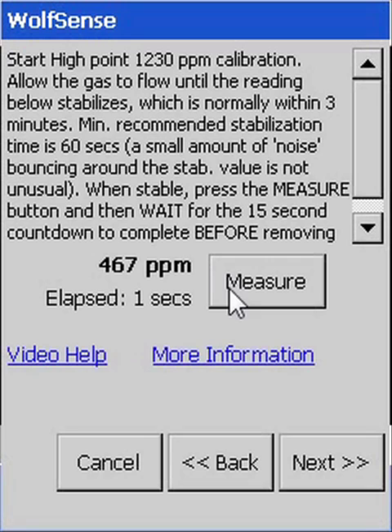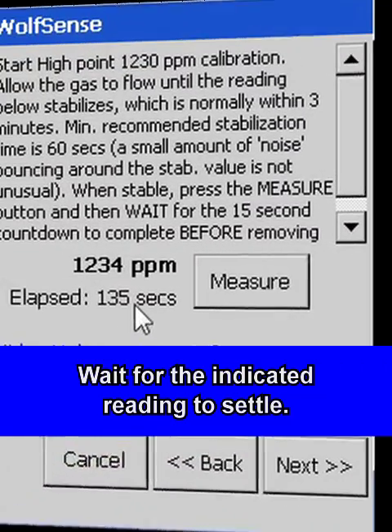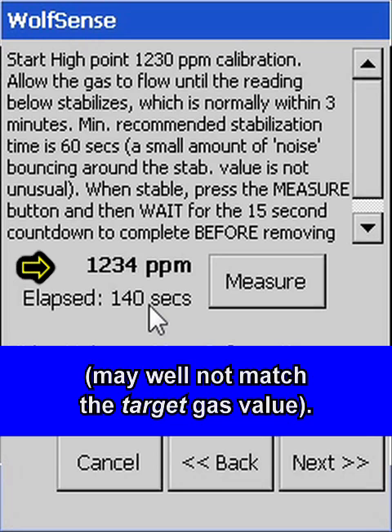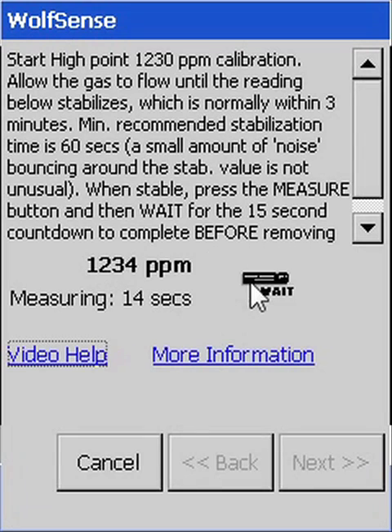Repeat the procedure for the high or gain reference gas. Two-point calibrations — first low, then high — are always recommended. However, near the beginning of the calibration procedure, you could have selected a single point, either high or low, if you are only concerned about one end of the sensor range.